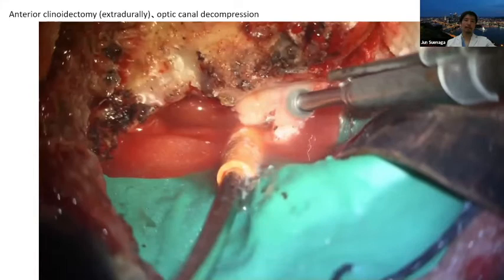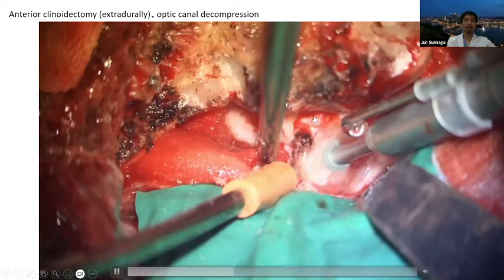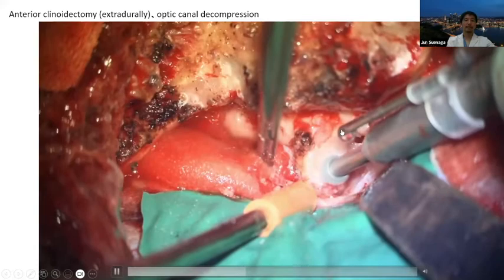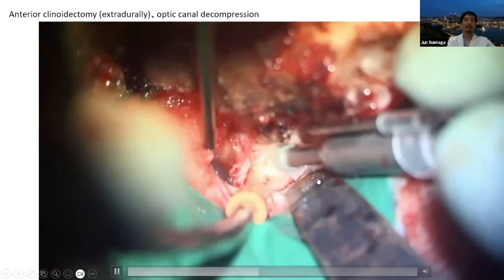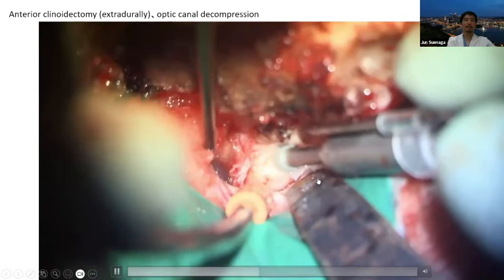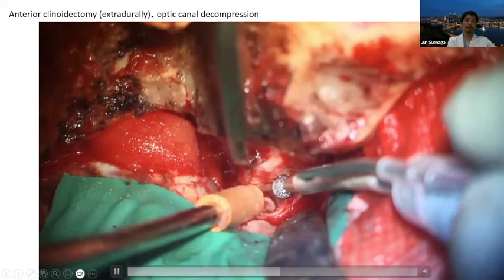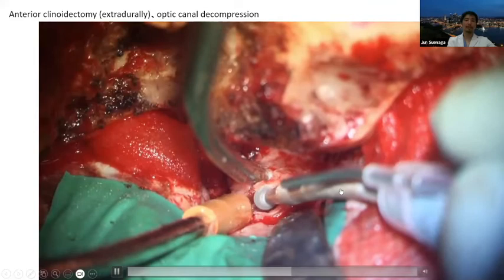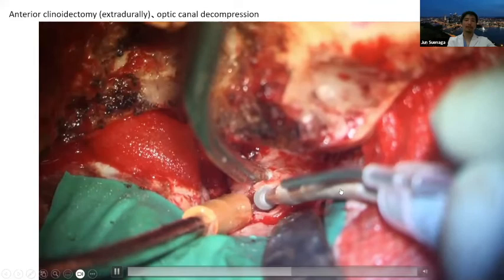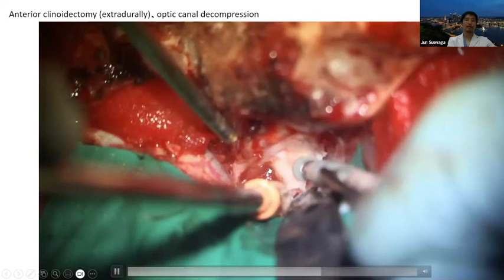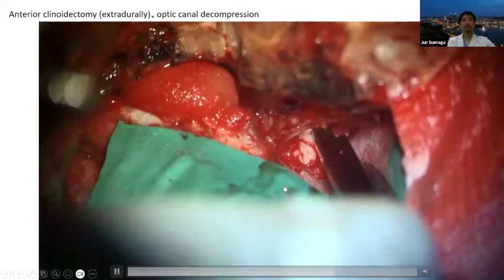The periorbita and optic nerve sheath are continuous, so I can safely drill the bone using the curved retractor. This is the distal part and proximal part of the optic nerve. The optic nerve roofing is drilled and finally the anterior clinoid is removed. This is my manner of the optic sheath approach, also utilized for other intracranial approaches — first opening the periorbita and confirming the dura mater is easy and time-shortening.